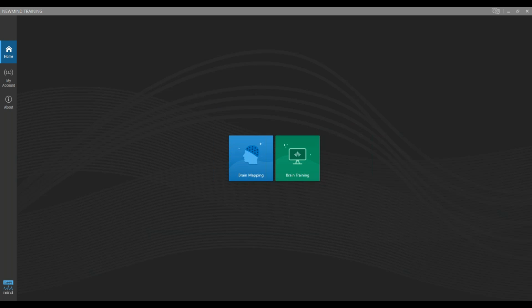Today, as advertised, Aaron will be talking about various aspects of software training. Some of these topics today will include recording qEEGs and stopping them, as well as can you play back a session. But there's some other questions that have arisen from the Wednesday session on artifacting and all kinds of electrical interference. So we're going to start off with that.